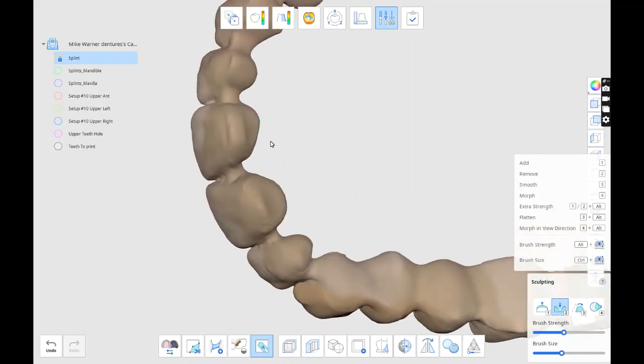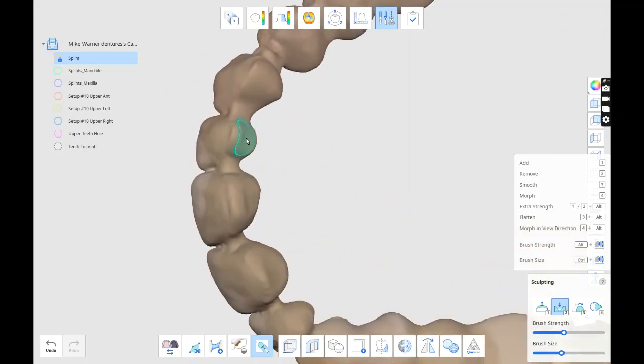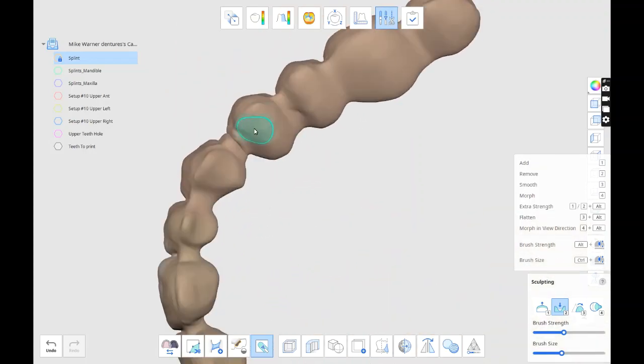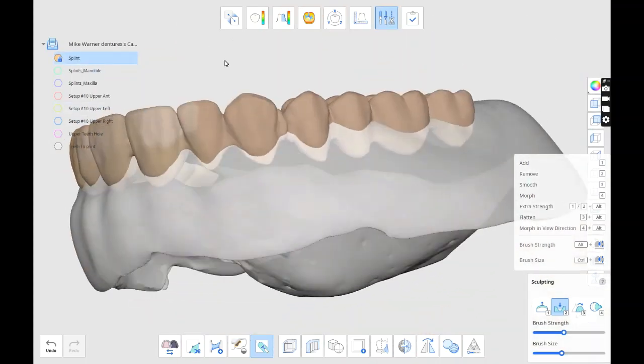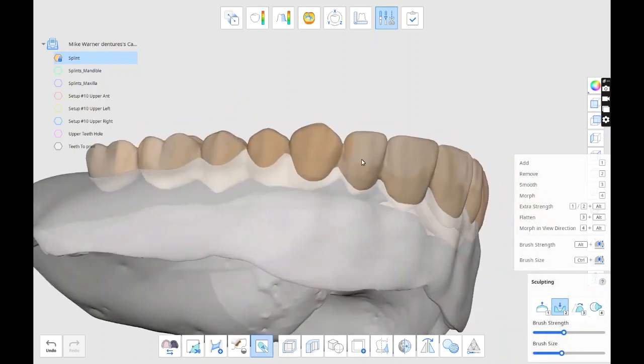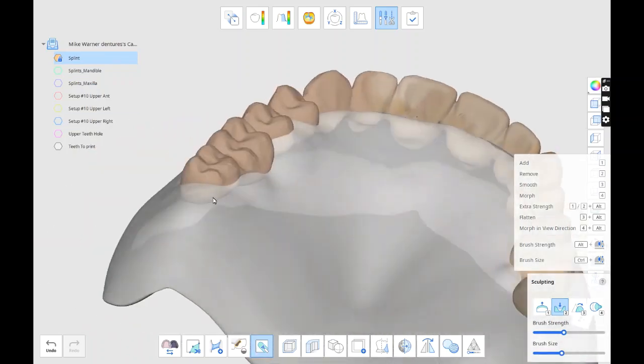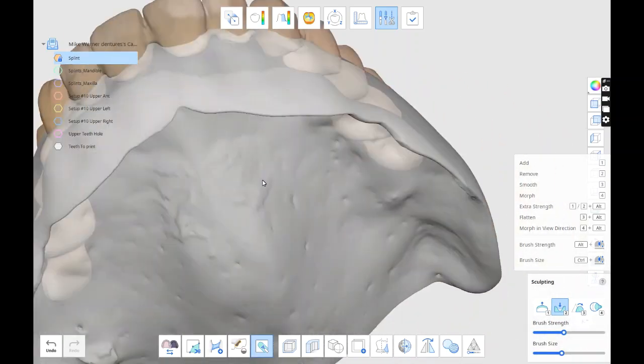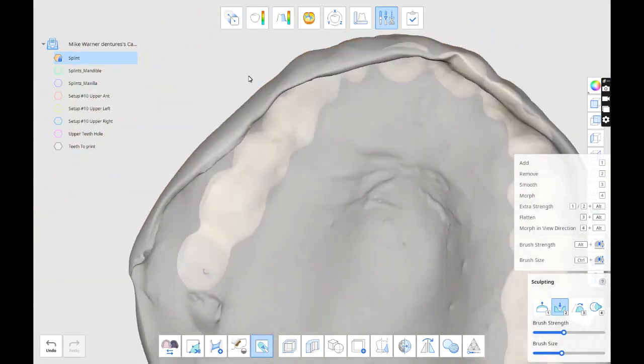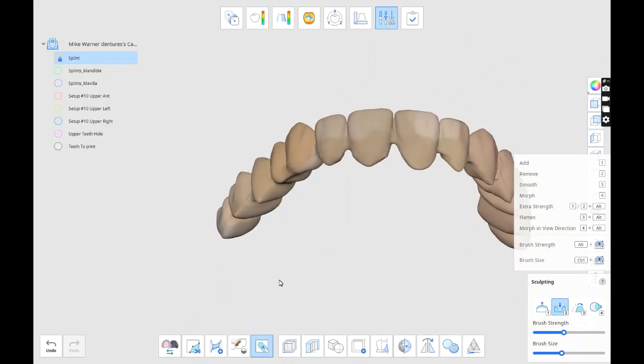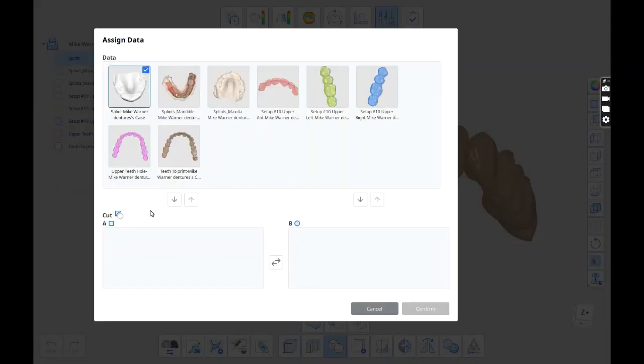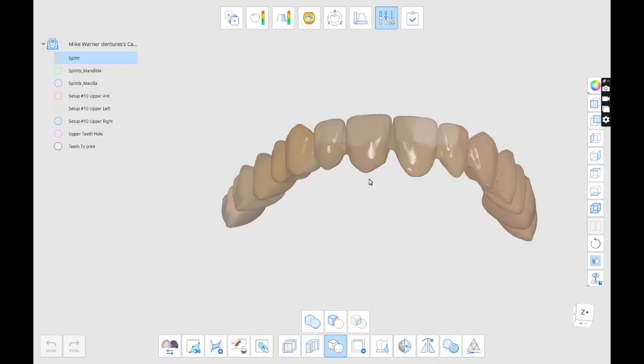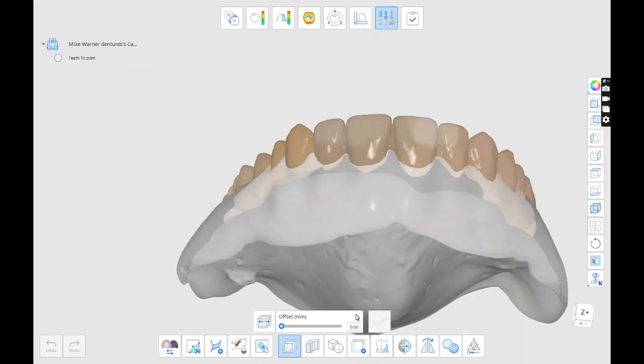And then just smooth it a little bit. I need a little bit more space. I like to have a little bit thicker base so the teeth don't punch through. The prints seem to be less prone to error if they're a little thicker. And then once that's done, I'll export them.